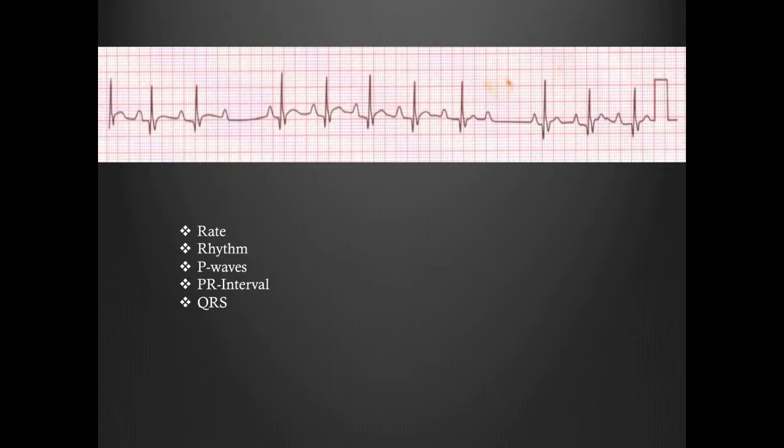P waves, are they round, upright? Yes, they are. Is there a P for every QRS? Every QRS has a P before it. Is there a QRS for every P? No, there is not. So check, that's a weird thing. Let's look at the PR intervals next. You know what? They aren't the same. They keep getting longer.